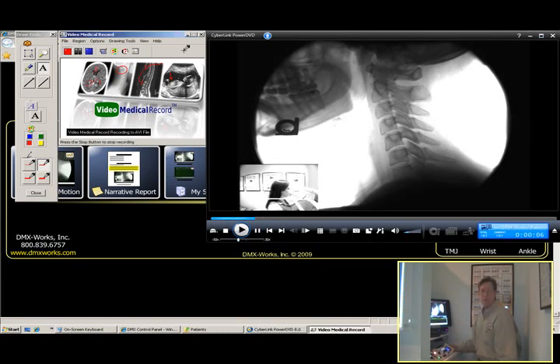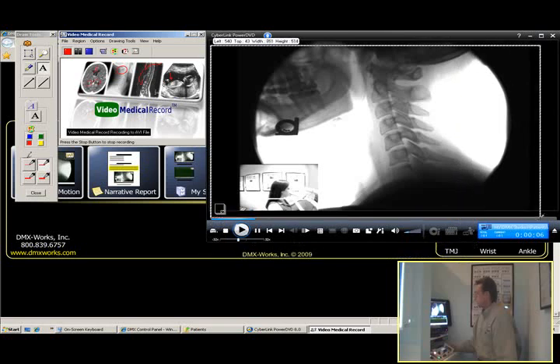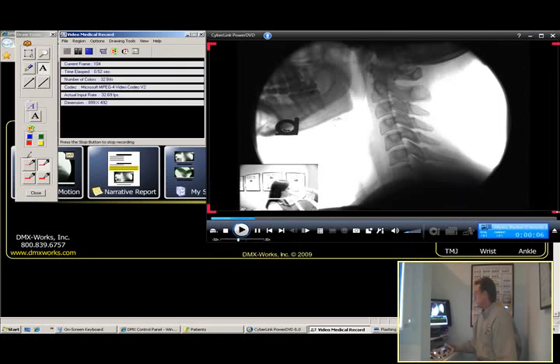Here we're going to see Rachel's flexion-extension motion x-ray. What I'm going to do is come up, hit the record button of her x-ray image, and square it off right there. That tells me that we're recording this motion x-ray as soon as we push play.